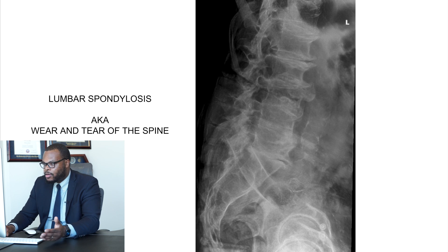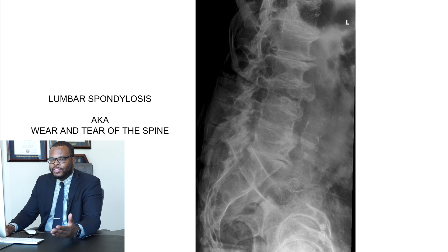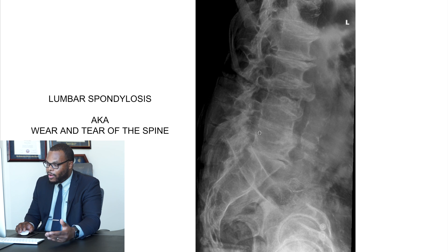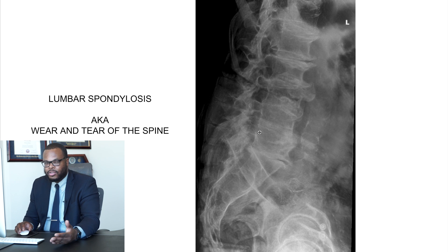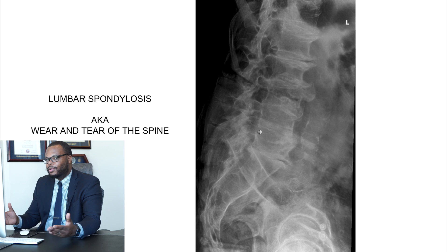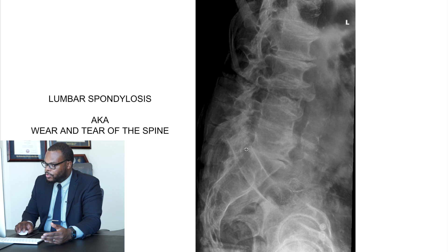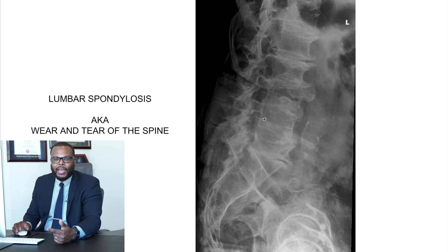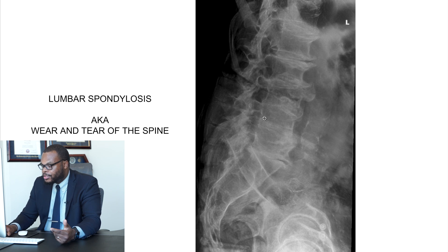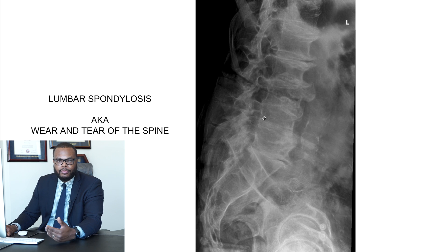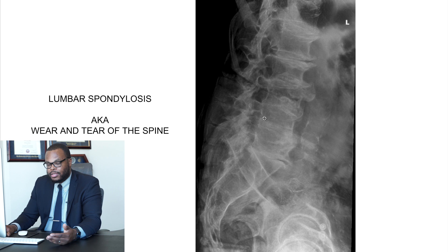Now a couple of cases. Lumbar spondylosis — this is basically the wear and tear of the spine, and everyone's going to get this as we age. You can see this patient has pretty advanced, severe arthritis. Just like you get arthritis in your hip, knee, or shoulder, everyone's going to get it in their back as well. I can't even see their intervertebral discs — they're pretty collapsed. Lots of bone spurs. They've lost their lumbar lordosis, which is the curvature in the spine, so the back is really flat. Most patients who have arthritis can be treated with physical therapy, anti-inflammatory pain medications, and sometimes injections.